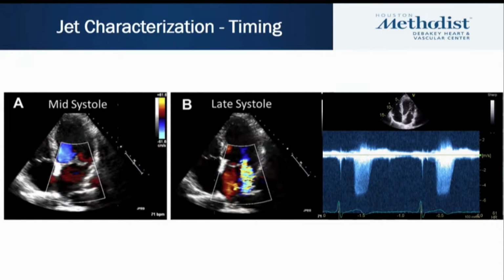Let's talk more about characterizing the jet. We've talked about determining the mechanism, which has implications on management options. What about determining the severity? Again, remember that timing of the jet is very important.